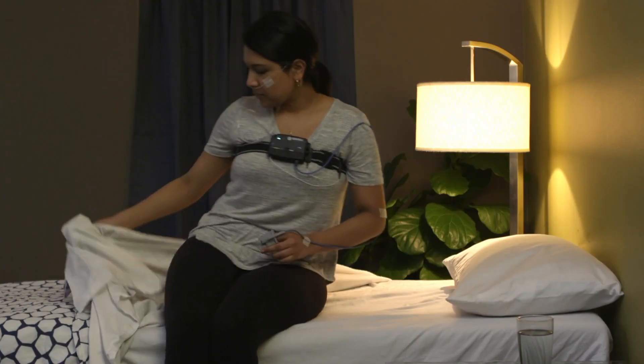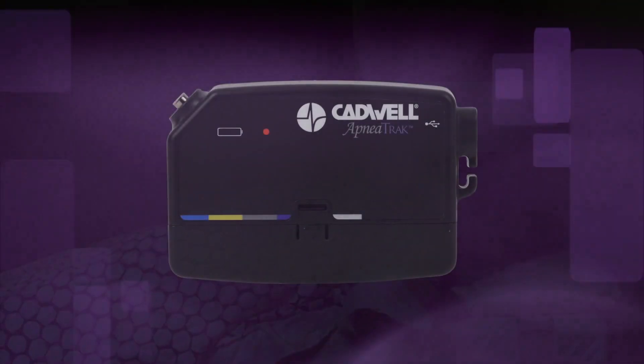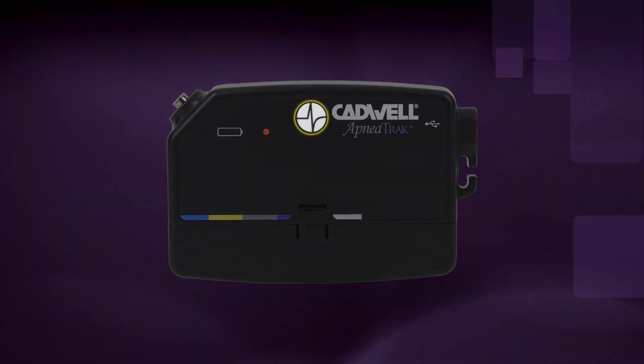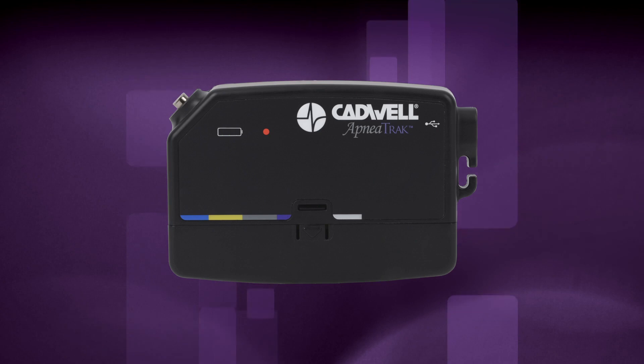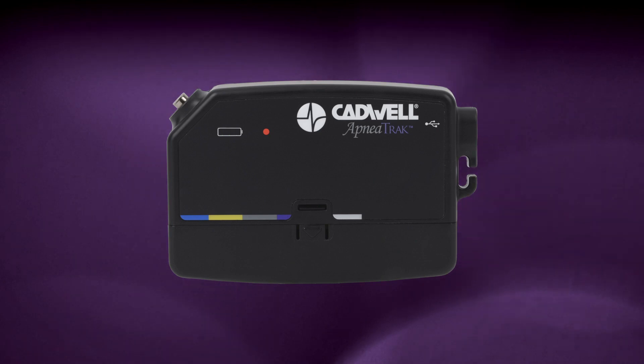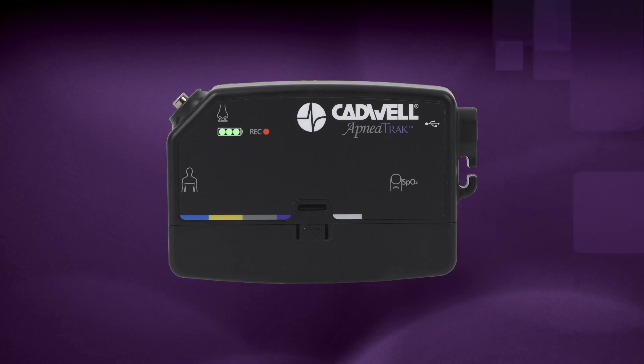If any cable disconnects, simply plug it back in and the recording will continue. To record an event for review, press the raised Cadwell logo event button once to mark an event in your sleep study data. Write down the time and the reason of the event for your physician to review. To check if the device is recording at any time, push the event button and the recording LED will illuminate for a few seconds.